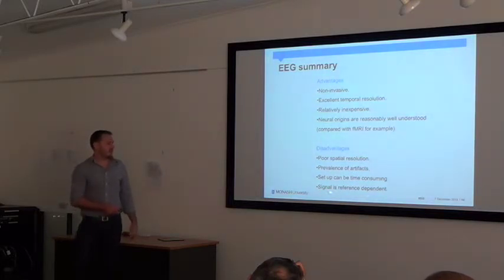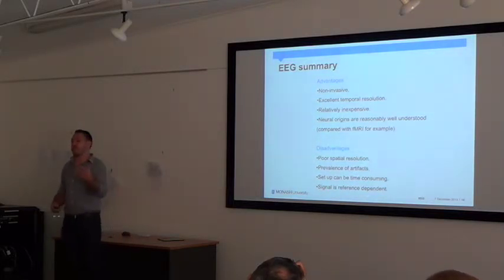And again, this idea that the signal is reference dependent. So whatever you're looking at is dependent on what you're comparing it to, essentially. So it can make it a little bit hard to compare things with other groups if you're not using the same reference. All right, any questions?